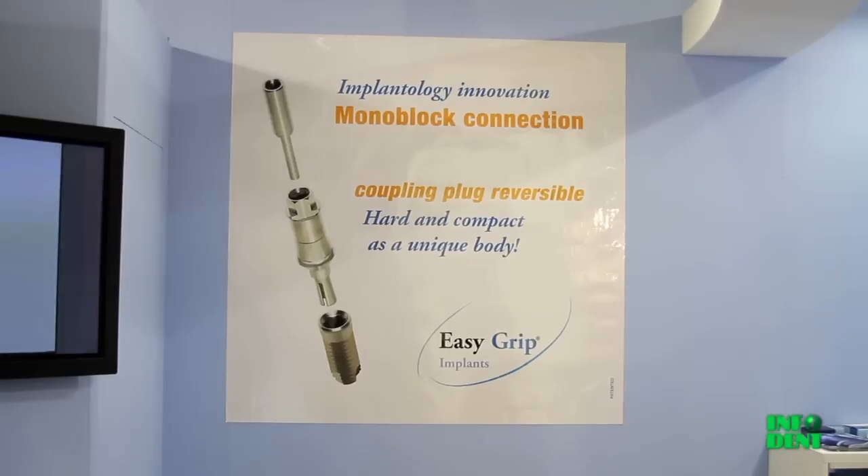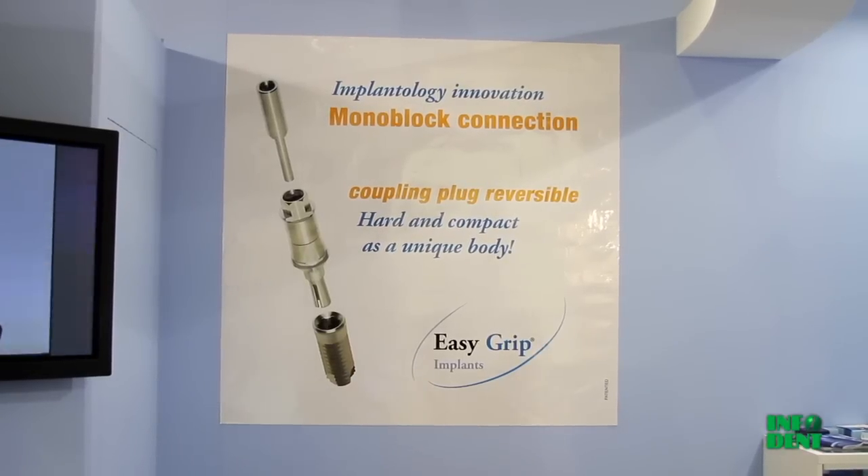In the implantology that I use by EasyGrip, there are two implant connection systems. The first is the classic internal hex screw that we all know, and the second is called Monoblock, which is a pin attachment system without threads. This is a patented system, which also gives the possibility of recovering the abutment, so it's not permanent.